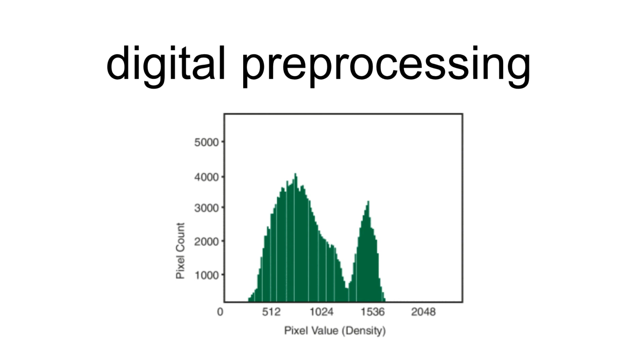Essentially, picture, if you will, there's a communication between the data that you generate with your X-ray, right, which is based on the anatomy and what exposure techniques that you set up, right? You create some kind of data, okay? Then, provided you choose the correct procedural algorithm, right, you choose the correct part, there is a set of data that is designed to represent the optimal contrast, optimal brightness for that particular procedure, right? Does that make sense?